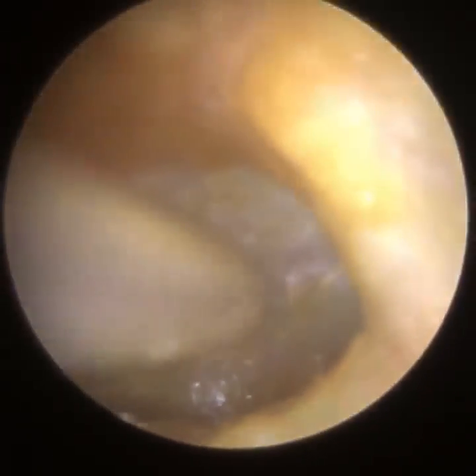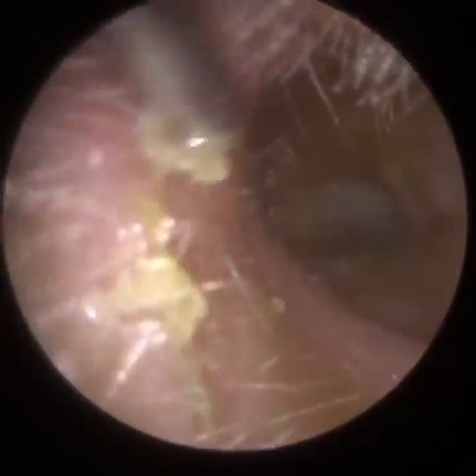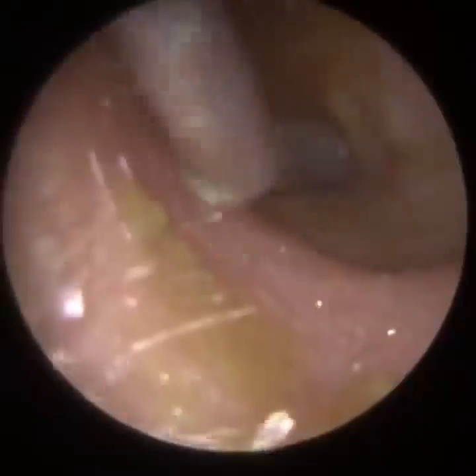I'm just thinking about some of the ClearWax delegates we train. Would I expect them to do this in the first instance? No, because it is quite complex. You're making contact directly with the eardrum, and also we're trying to remove all this debris off the bony part of the ear canal. So it is a very tedious procedure.